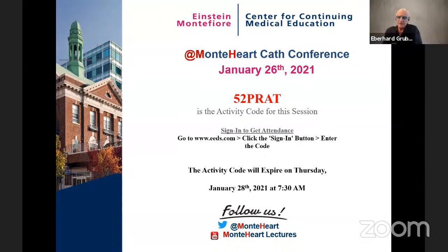Azim, can I ask a question? Please. So Antonio, as Azim said, filled with a lot of experience, the whole coronary field owes you a lot. We are used to, you use very high pressures. You said, I go up to 44 atmospheres. Most of the time, you don't even have manometers to go that high.